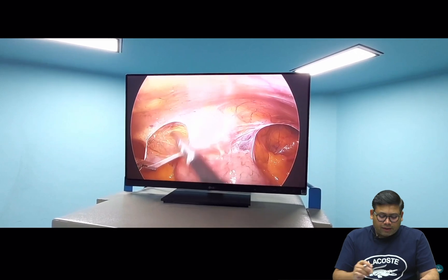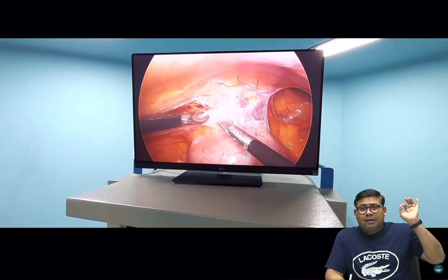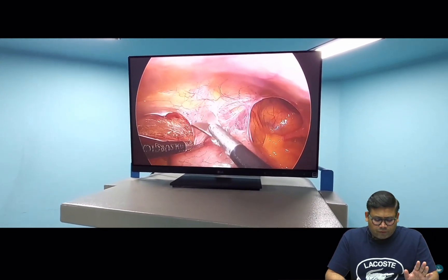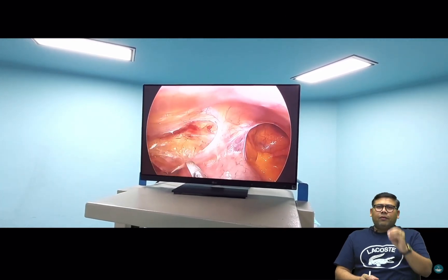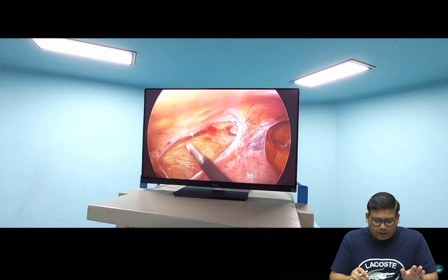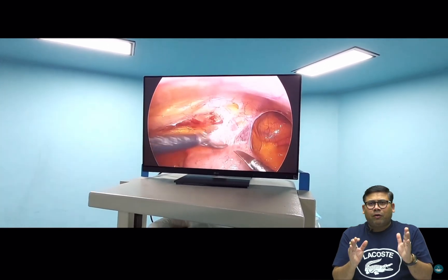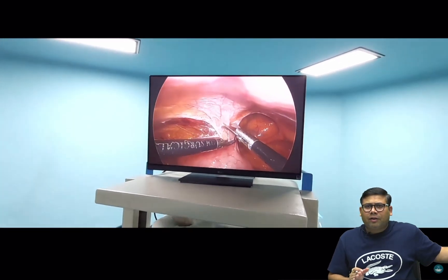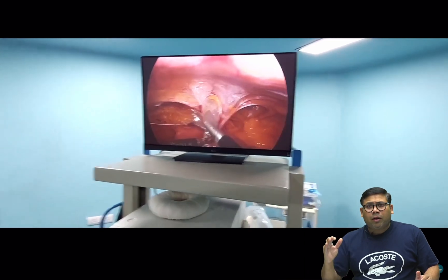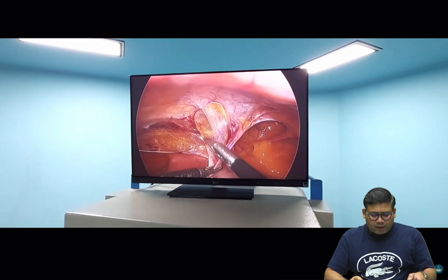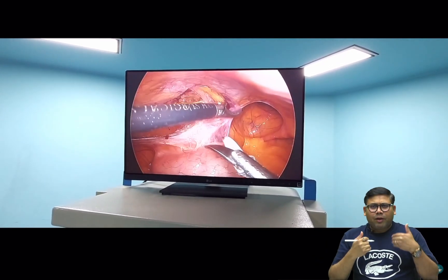You can see this avascular space — this is classically known as the space of Bogros. No energy device is needed here; only a grasper and scissors are required. With my Maryland grasper I maintain traction-counter-traction. If you stay in the right plane and don't cut the fascia you'll never encounter bleeding. I want to cover the myopectineal orifice; lateral extent of dissection is ASIS and medial extent is the medial umbilical ligament — lateral border of the bladder.